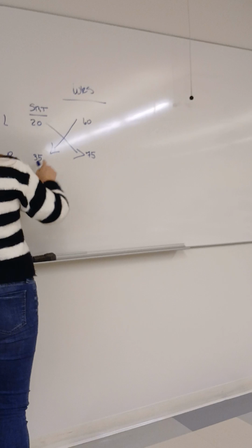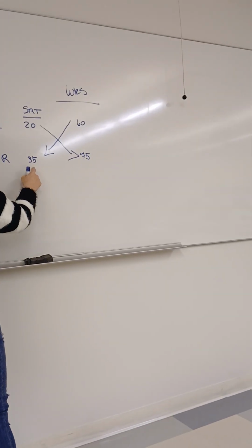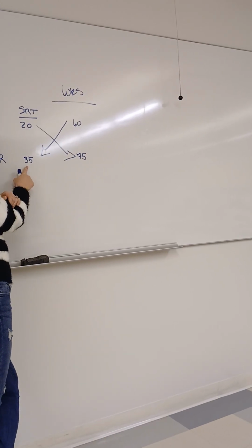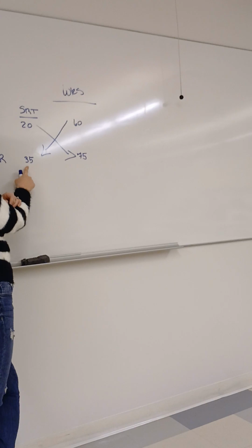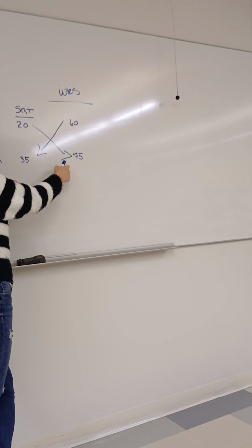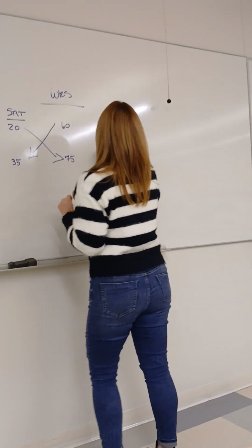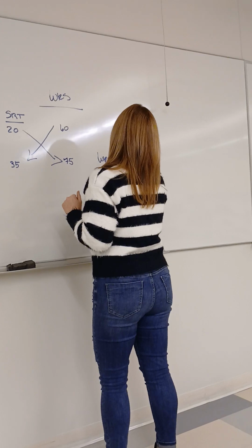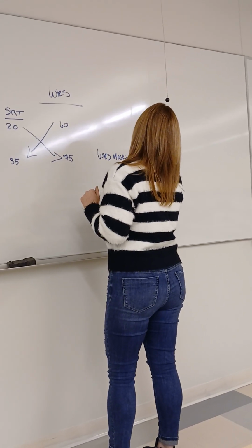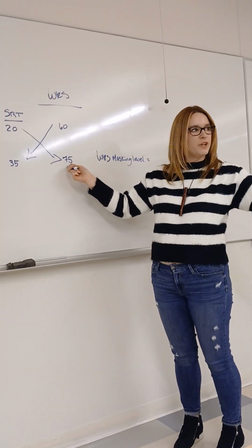So, looking at the difference between your word recognition of your test ear and your SRT of your non-test ear, would we need to put masking in the right ear for word recognition? No, our difference is 25. What about here? Yes, you would. So, your word recognition masking equals your presentation level minus 25.